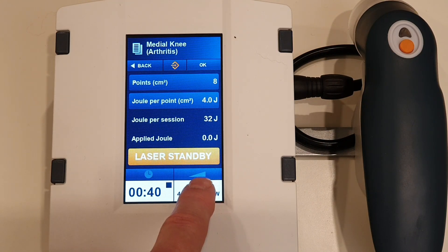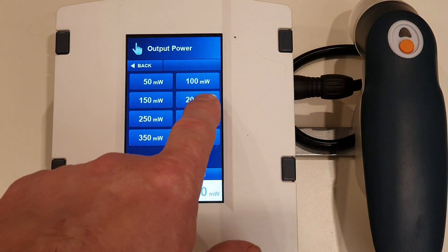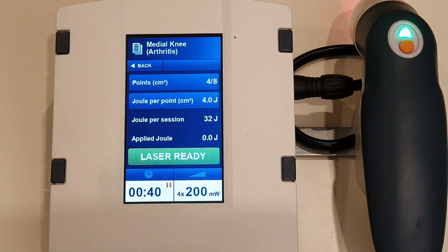If you were using the 100 milliwatt probe it would simply look like four times 100 milliwatts, and of course the time would double. We're going to use the slightly stronger one today. Once we press OK we're ready to apply this to the patient.